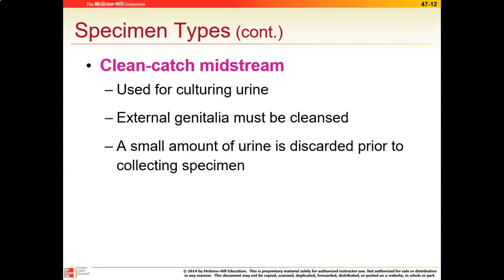Okay, and this is once again important. If the person doesn't use the cleansing pads, then it could have a lot of contamination. It may be difficult to get an accurate culture. Okay, so being able to describe this to the patients is important because they need to realize how important the cleansing process is. Okay.